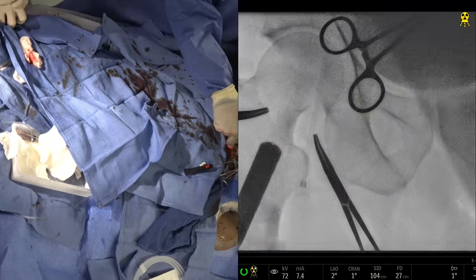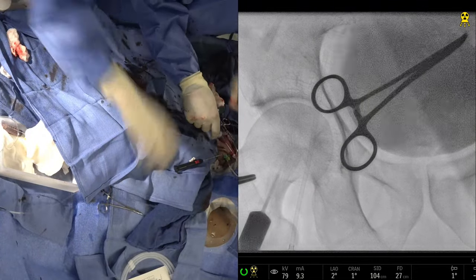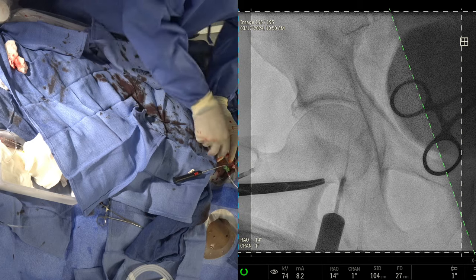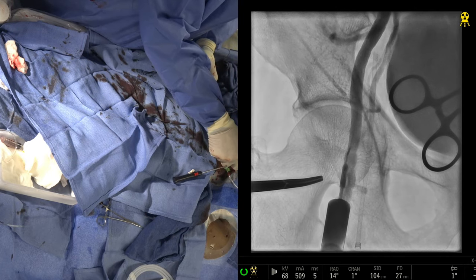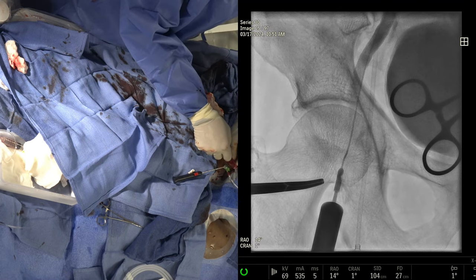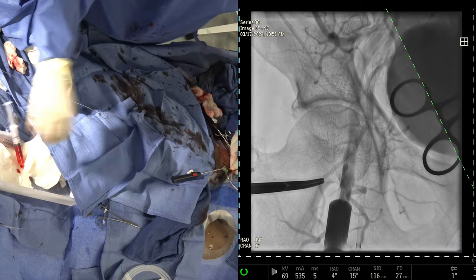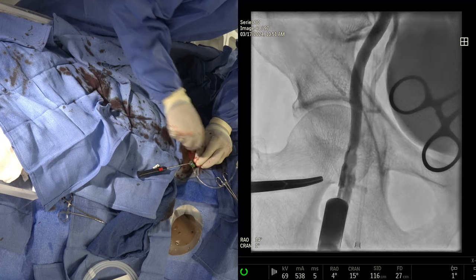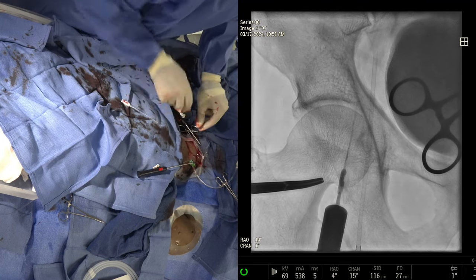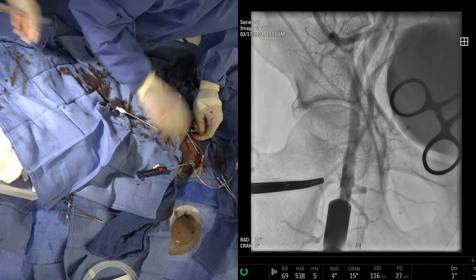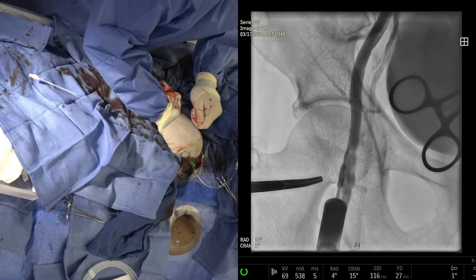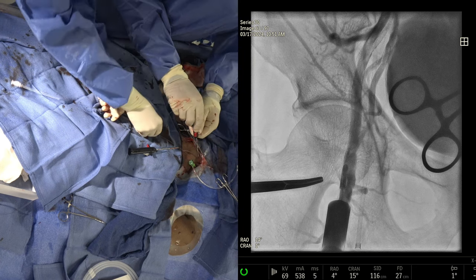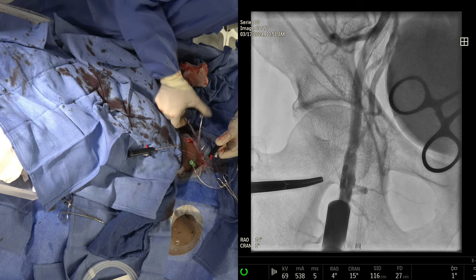Micropuncture in and wire out. Injection shows the vessel looks good. They go back with the wire, and before locking push the blue suture threads again to ensure sutures are over the wire. There is no bleeding. The co-fellow removes the wire. Then the sutures are locked one by one — first suture locked, no bleeding. The Impella was connected to pressure the whole time: it gives you reliable pressure measurement and prevents thrombus formation — very important in shock patients.